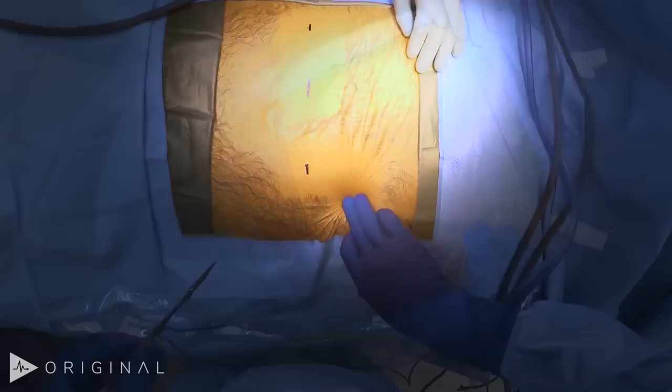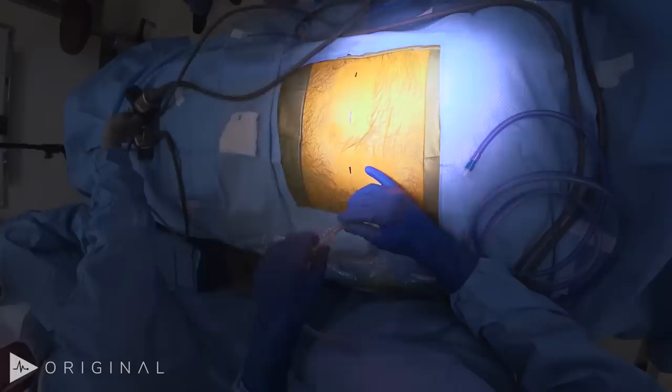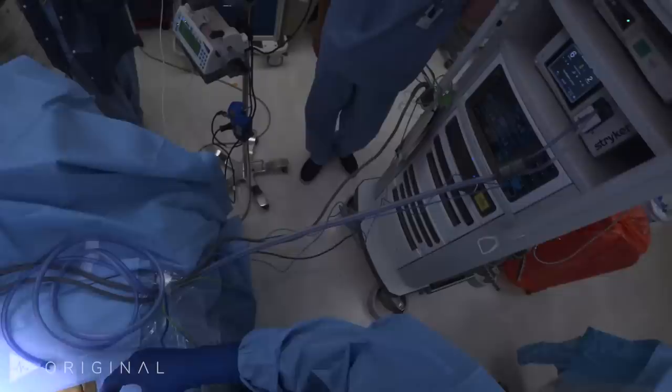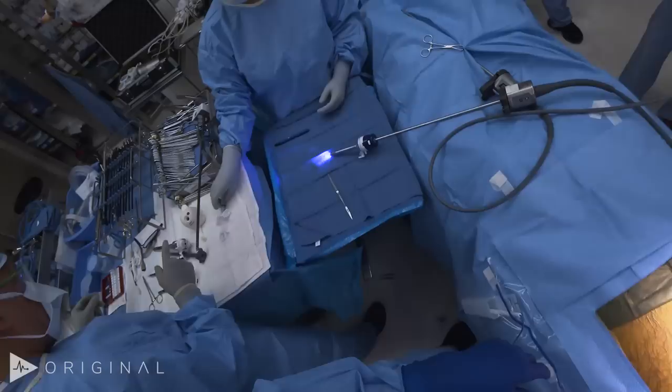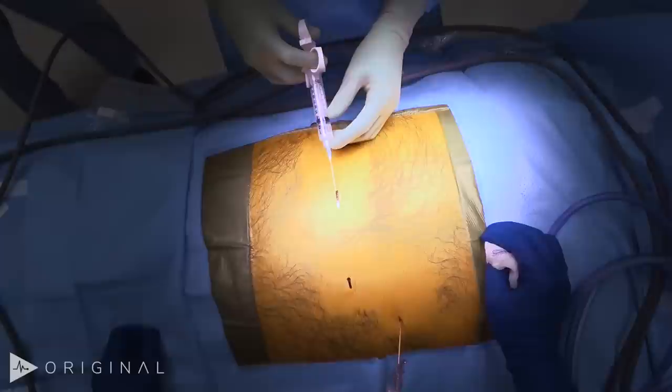We're going to achieve pneumoperitoneum using a Palmer's point technique. I make a small stab at Palmer's point and introduce a Veress needle into the abdomen. As we're insufflating, I always check the vitals — 100 over 68, pulse of 62, end-tidal 37. Opening pressure is low and gas is flowing, so we've found the peritoneal cavity. We'll numb up the skin incisions with local — a dermal block where we put the ports in as a preemptive analgesic strategy. We'll also close the fascia of the 12mm port with a suture and do a rectus sheath block later in the case.